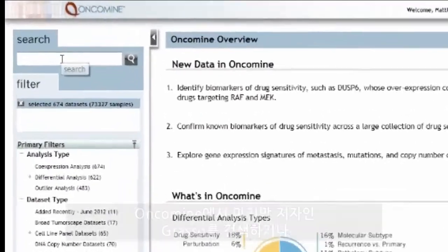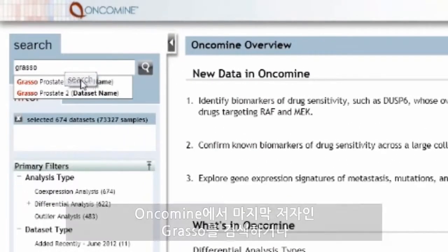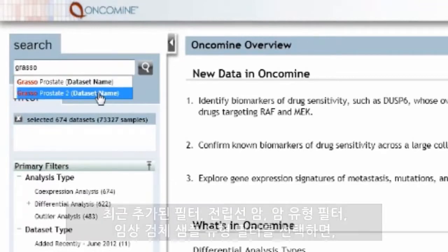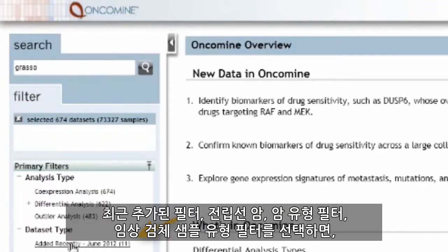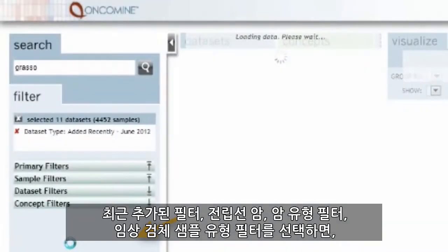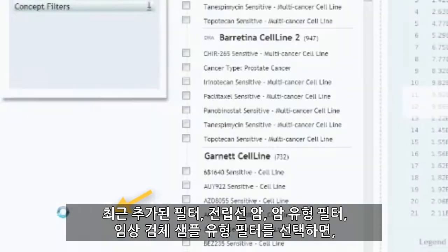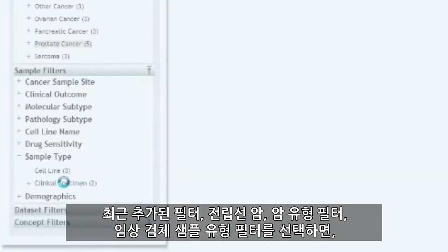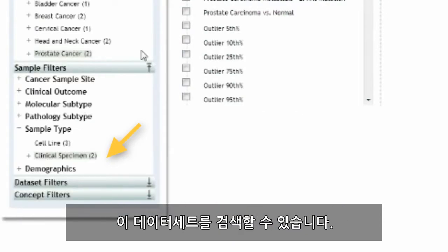By searching in Oncomine for last author Grasso, or by selecting the recently added filter, prostate cancer cancer type filter, and clinical specimen sample type filter, we'll retrieve these datasets.